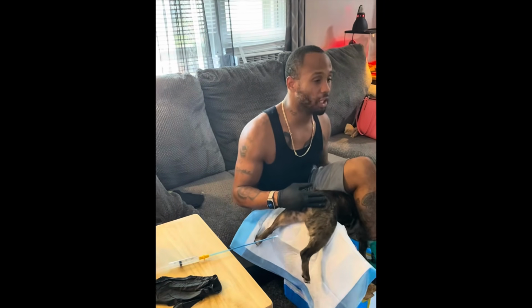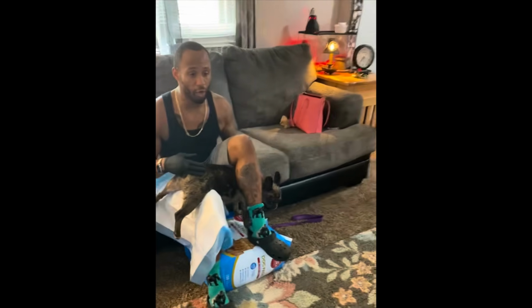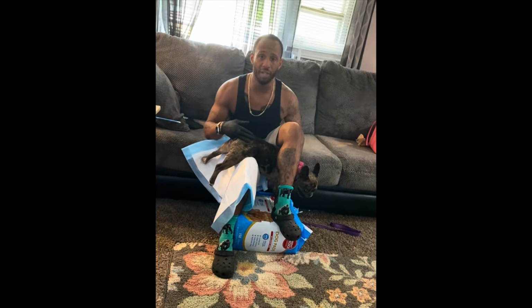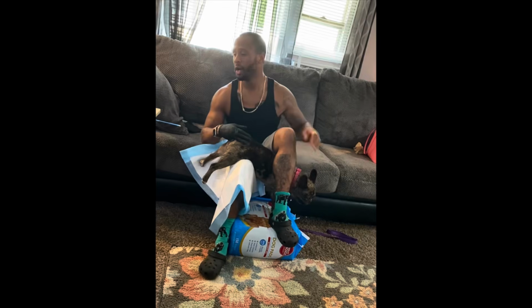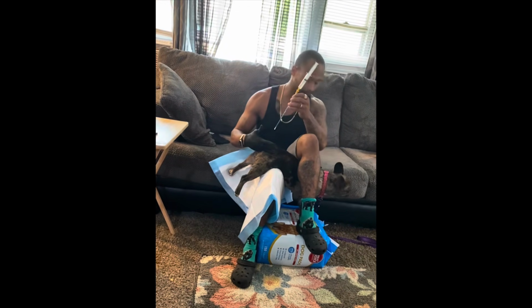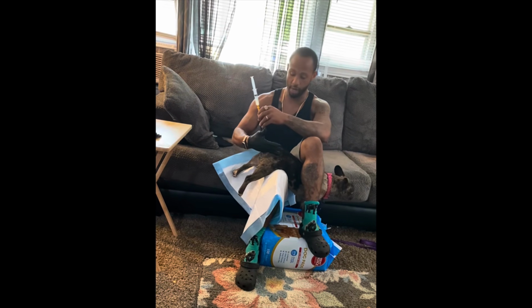Once again, if your dog is small like her, you would need to find something that's comfortable for her, a certain seating that's actually comfortable for her, because if it's not comfortable for her, she would definitely want to move and get up and change positions, and that'll make it real hard on yourself, especially doing it by yourself. My wife usually helps me with keeping her calm, you know, rubbing her neck and stuff like that, but she's behind the camera right now.